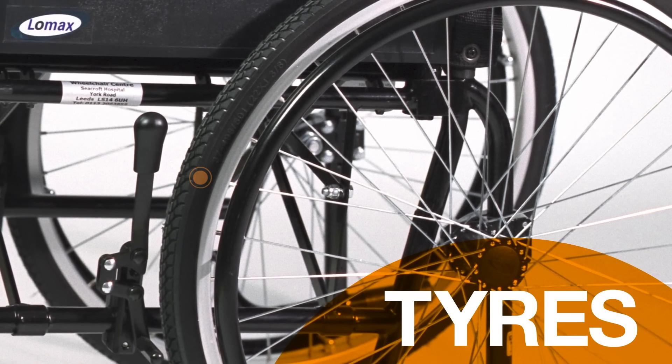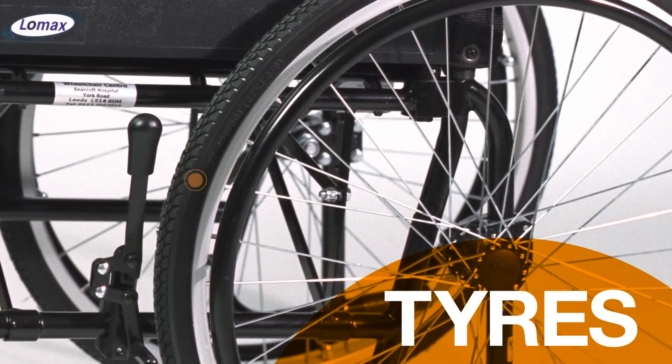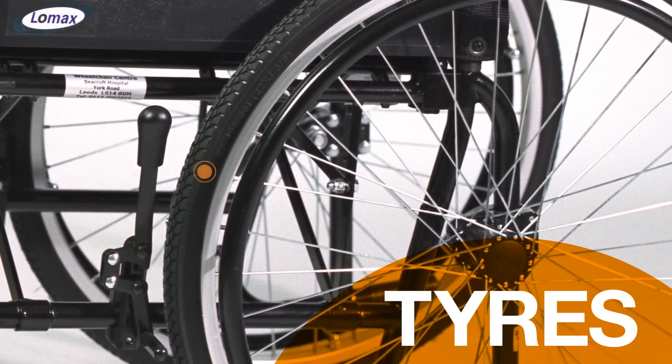Tyres are usually solid rubber, but occasionally may be filled with air like on a bike. These should be inflated to the pressure written on them, so that the brake pads can work properly.